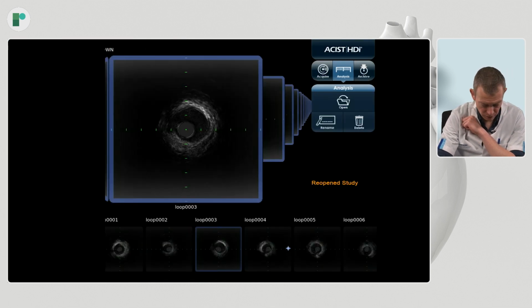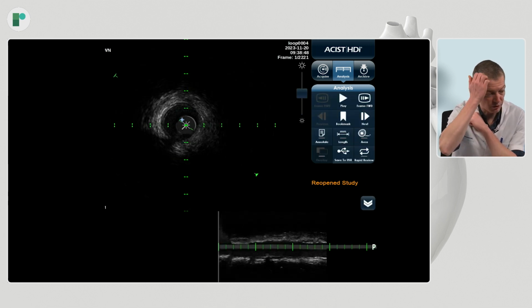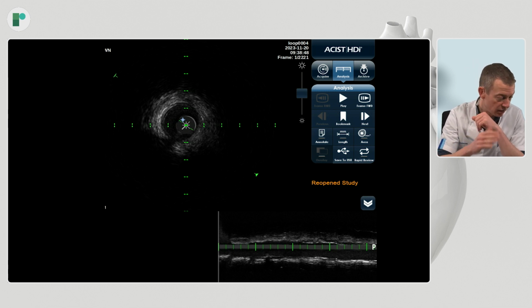Take you to pullback number 4. So again, no focus on the diagonal yet. We have seen the ostium of the diagonal was healthy. There was no clear plaque, so I think no discussion as to whether we should have proceeded into a two-stent strategy here. And with all the literature that we have on hand at this time and age, I think there is no argue that a provisional approach should be standard of care unless there is a reason to opt for a two-stent strategy. But standard of care, in my opinion, specifically with side branches that are relatively small, provisional.